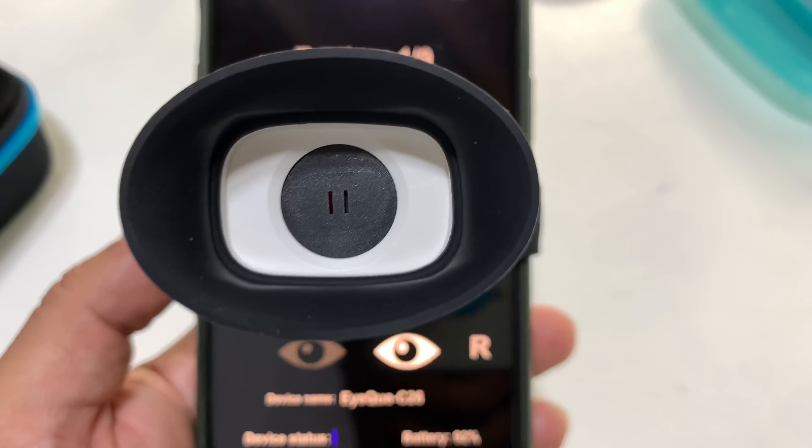When you activate the app, it's going to tell you which eye and which step of the vision test you're at. You're going to bring this device up to your eye — there are a couple of little slits in there — and if you can't see through them, kind of move your eye back and forth because your pupil needs to be lined up with a little slit.